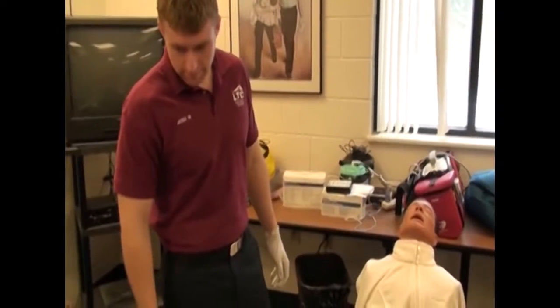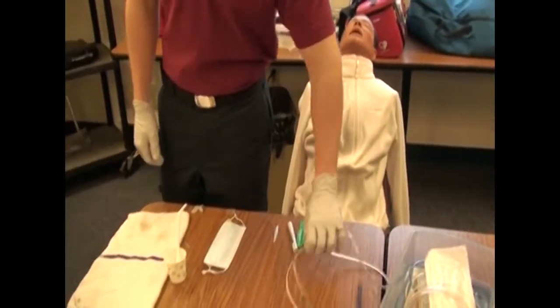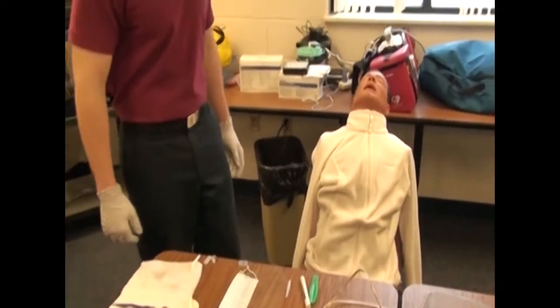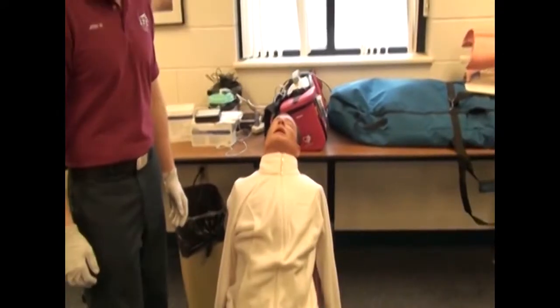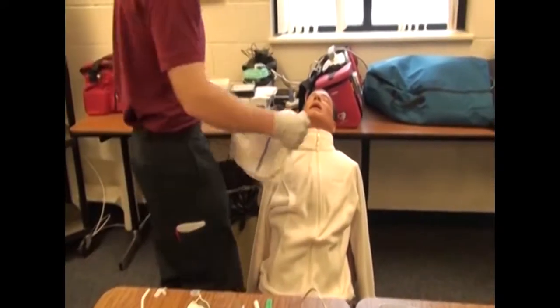This is nasogastric tube insertion. Assemble equipment. Stand on the right side of the cot if you're right-handed or vice versa. Patient should be in Fowler's position. Place bath towel over client's chest.